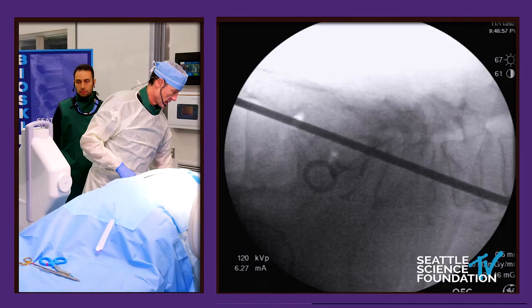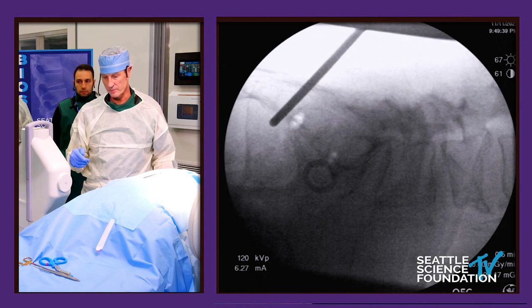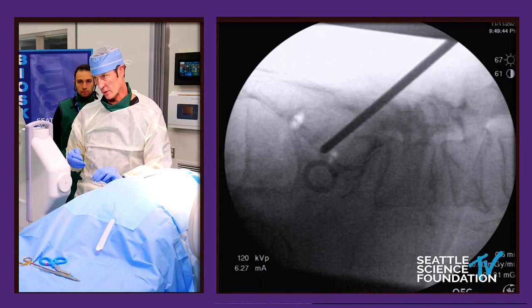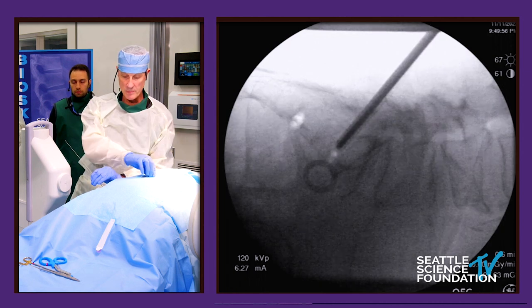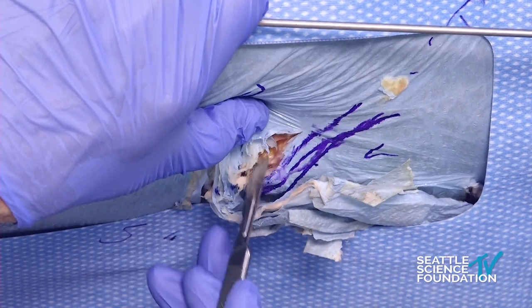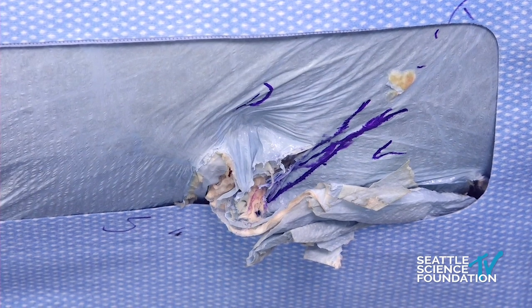The first thing we're going to do is get a mark as close to S1 and S2 as we possibly can. We mark here and then go over to the fluoro. That's right at S1-2. We go a little bit dorsal — that's right in the middle of S1 — and that's our start. We make the incision here: a small incision, only about 1.2 centimeters, right at that point because that's our starting point for S1.